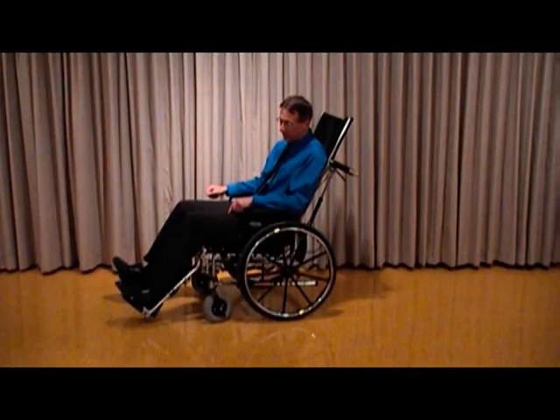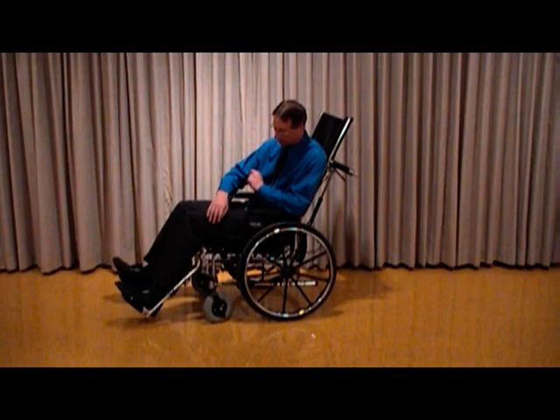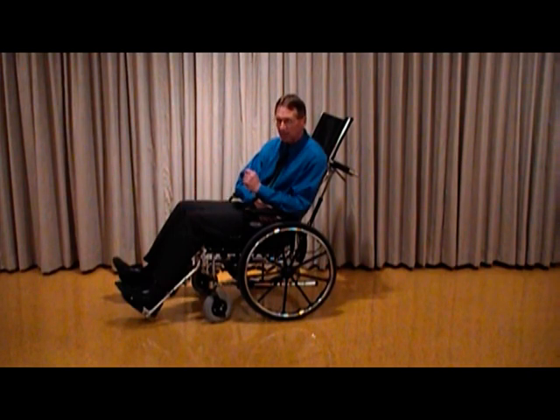Okay, in this instance now, the leg rests are actually adjusted correctly, and it's so much more comfortable. What you want to look for is that the legs are adjusted to the extent where your thigh runs pretty much parallel to the cushion. And as a rule of thumb, generally the knees are just slightly higher than the hips. You want the pressure to be spread evenly along the thigh here.